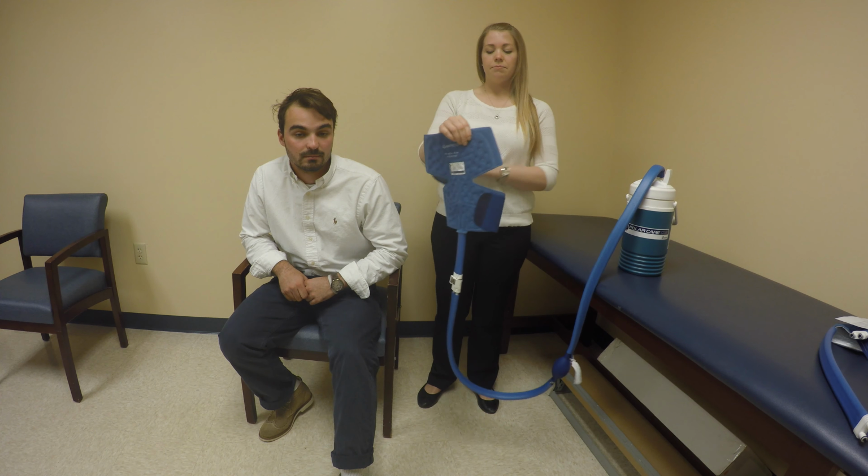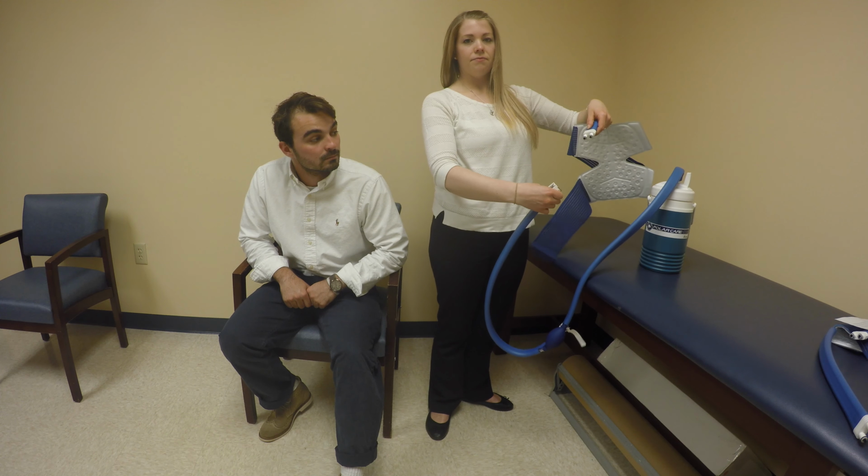When you're ready to remove the wrap, you can detach both straps and remove from the knee. You can then hold the wrap above the unit and squeeze the water out to make sure that it all goes back into the unit. It can then be detached by pressing down on both silver buttons and pulling away.